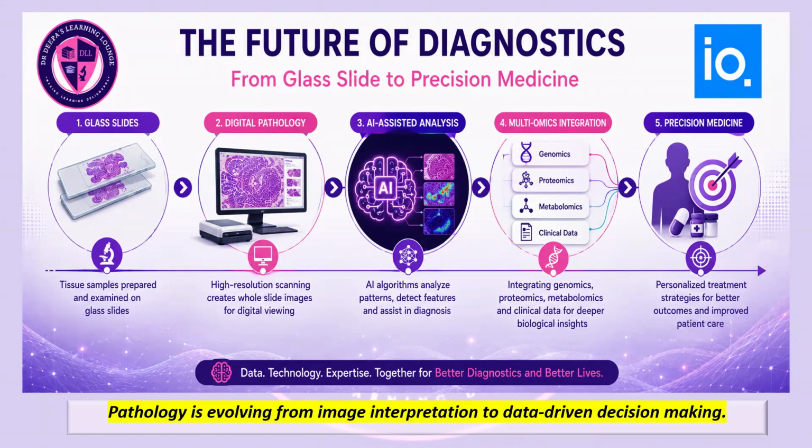So now, beyond the AI is what? Beyond the AI, we are doing something else now. What is that? That is computational pathology. What is computational pathology? Computational pathology is where tissue morphology is clearly integrated with molecular pathology, with genomics, with radiology, with laboratory medicine, with clinical information, and you get an in toto picture.